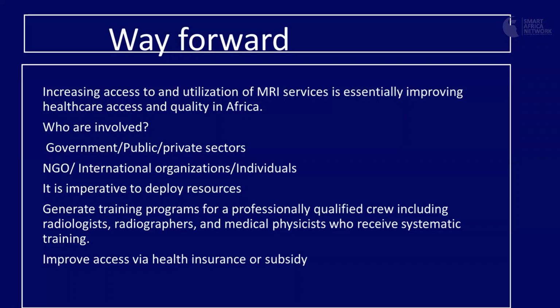It is very imperative to deploy resources for acquiring this machine, for the installation, and for the maintenance of the MRI machine. Professor Wele already talked about the need, because we need a professionally qualified crew to run an MRI system. The radiologists, the radiographers, and medical physicists should receive continuous training.